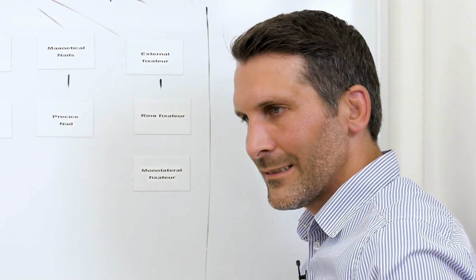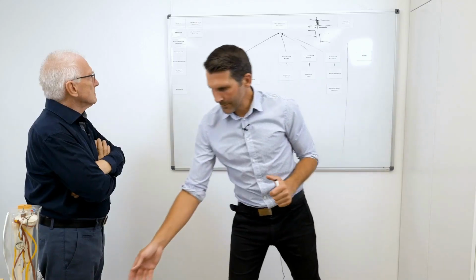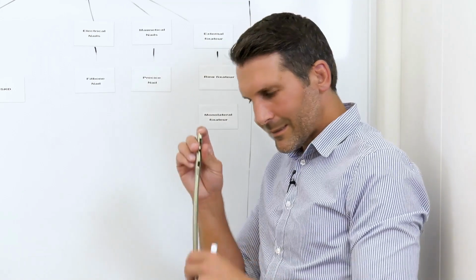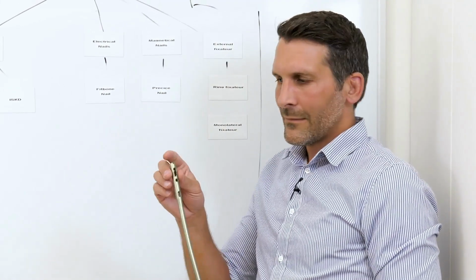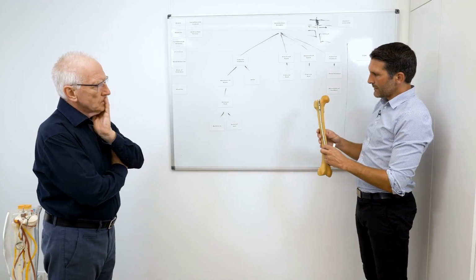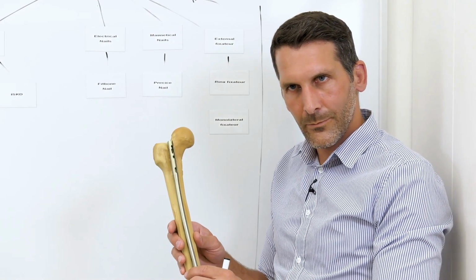Then basically nothing else happens than that you have a rigid, solid nail. It would look like this. This rigid, solid nail does not have a system integrated for extension. That means it's nothing other than a complete nail, which is also used in accidents.